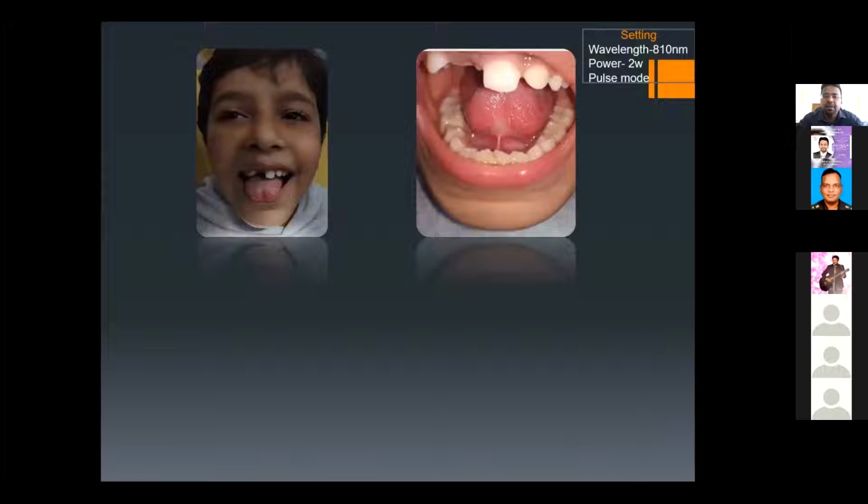This was an adult patient, so she cooperated well for the procedure. But do you think in a pedo patient it is possible? They'll not allow you to suture on the ventral surface of the tongue. But in such cases, laser will be a good option to perform those procedures. Let's see a case of tongue tie in a pediatric patient.